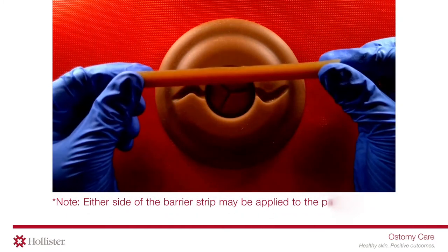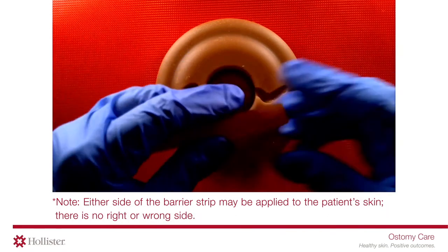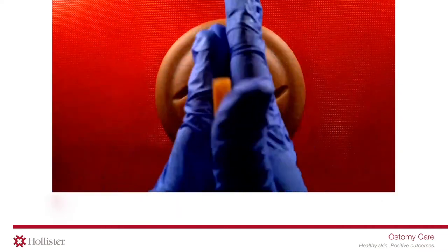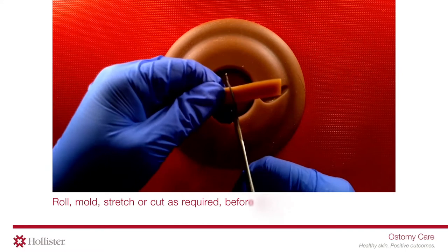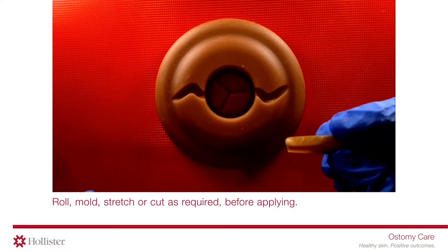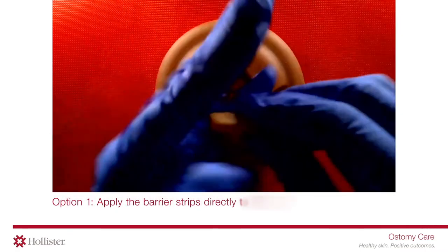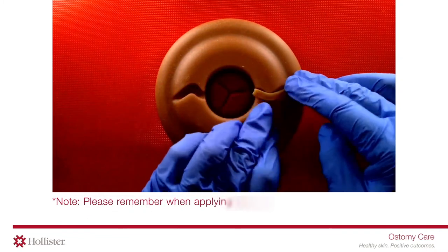Either side of the barrier strip may be applied to the patient's skin — there is no right or wrong side. Roll, mold, stretch, or cut as required before applying.